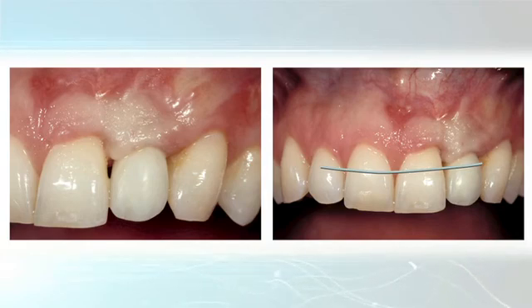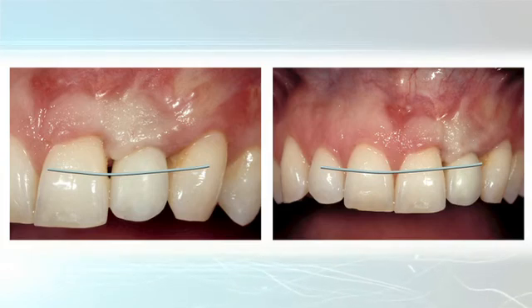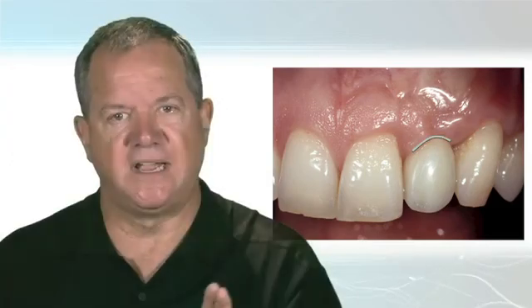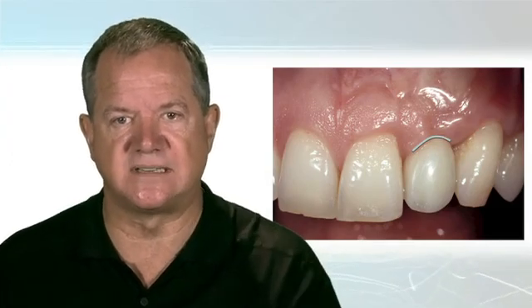And ideally, because the bone on the distal of the central is actually pretty good, we know that papilla is going to plump up a little bit higher, because if we have bone on the distal of the central, we're going to get a decent papilla on the distal of that central eventually. Here it is at about 4 to 6 weeks. And at about 4 to 6 weeks, the interproximal is looking pretty good, but the scallop of it is still quite flat. And if we compare it to the other lateral, it has a very nice, pretty scallop.